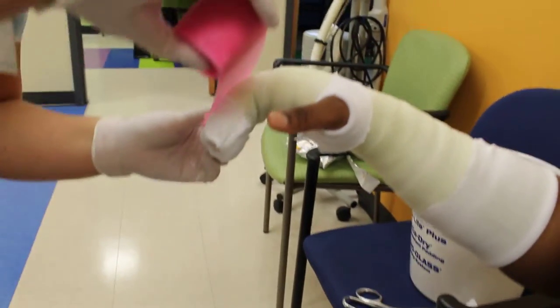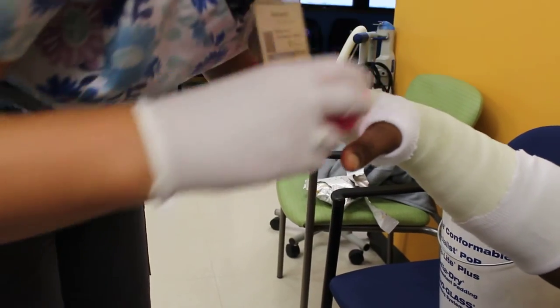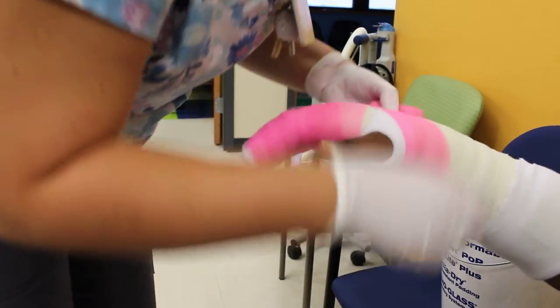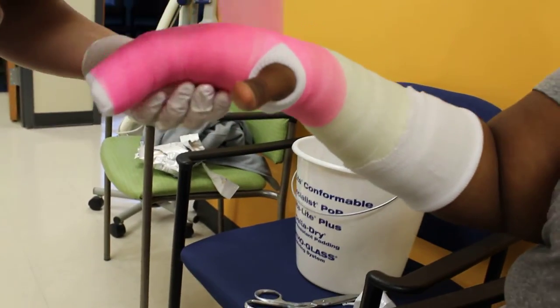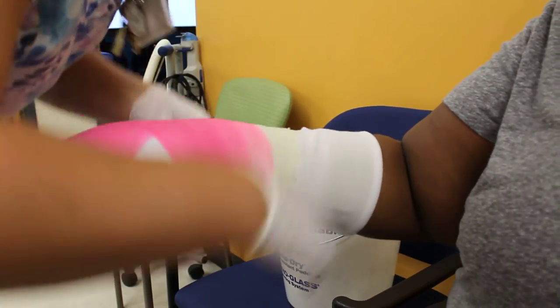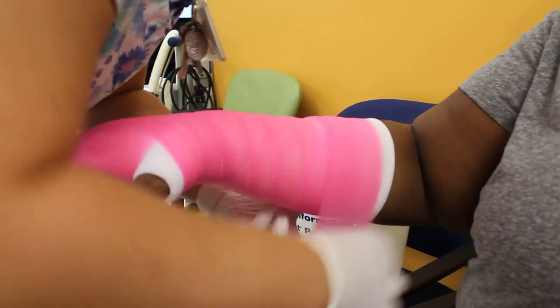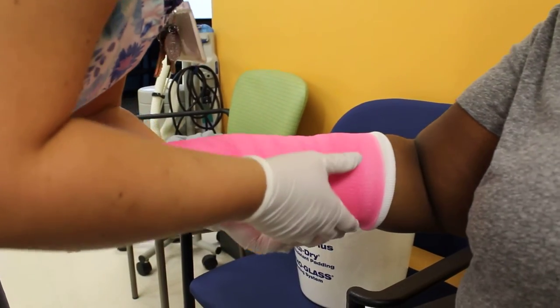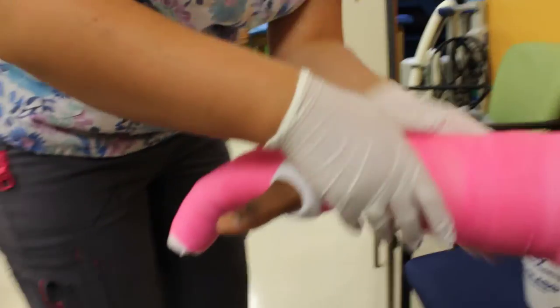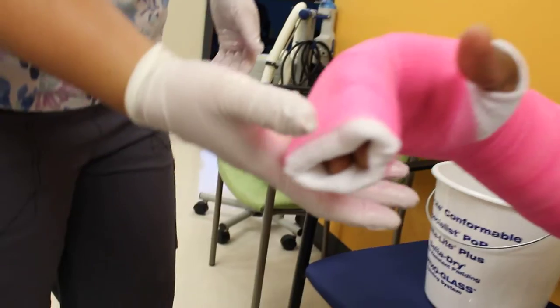Just as before, we're going to start at the fingertips, go over twice, and overlap by half. I like to go over the knuckles just one more time, then overlap by half again. I'm going to hold it there and let it dry — one, two, three, four. All right.